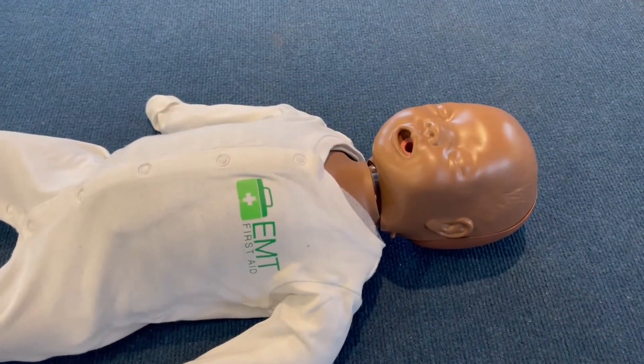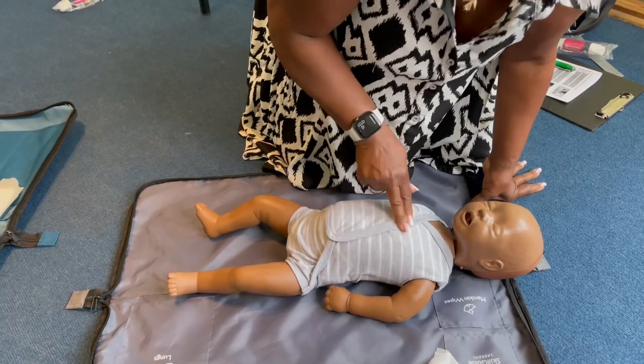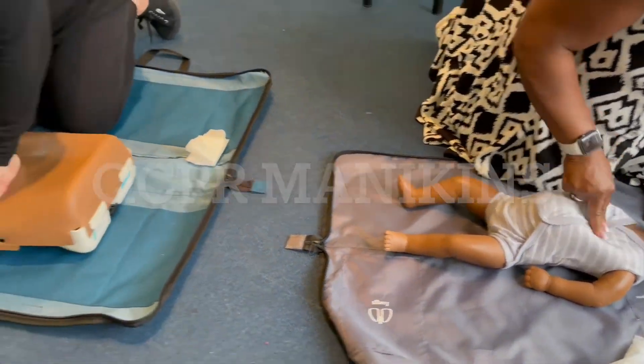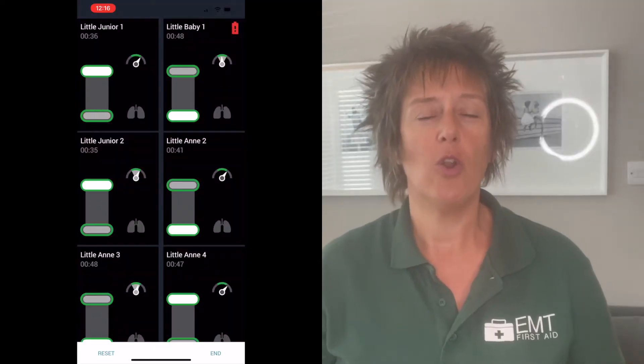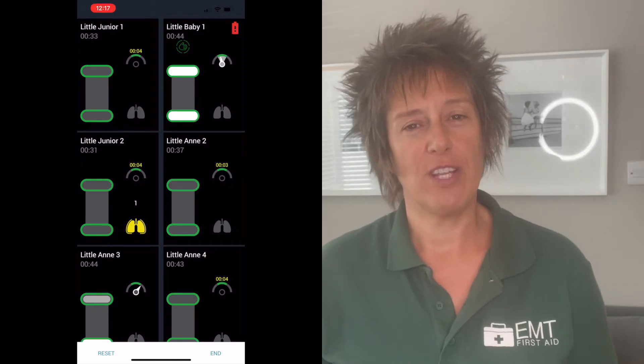So you can see how effective you are with your compressions, because they're not just normal babies and children — they are the same as the adult range we already have. The QCPR mannequins give you real-time feedback about how good your compressions and rescue breaths are on all the mannequins we're going to bring to you on our training courses. Please make sure you listen all the way to the end of the video.